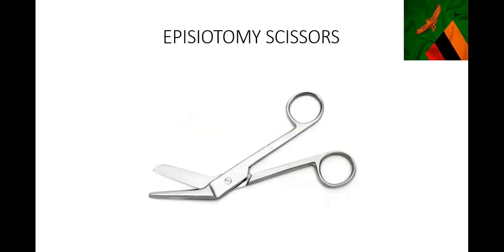This is an episiotomy scissors. It's something you should know. I'm putting it here because many times on the labor ward we are improvising - we don't have the correct instrument, and some people are using blades to do episiotomies. So this is the correct instrument. You know it has this funny shape to be able to go through the vagina and cut the outside at the same time - that's why it's shaped like that.